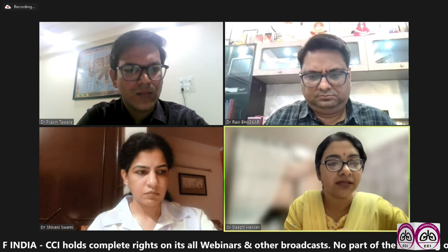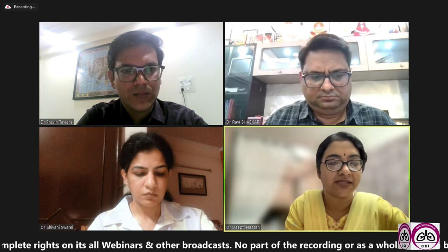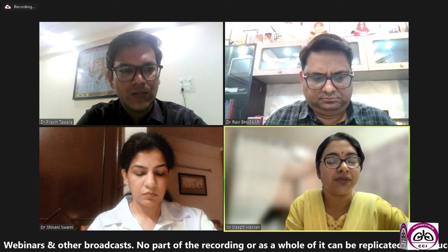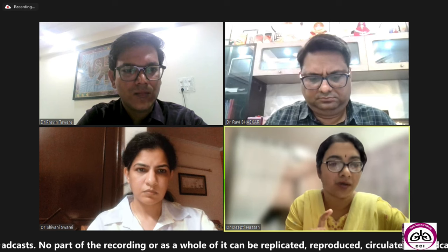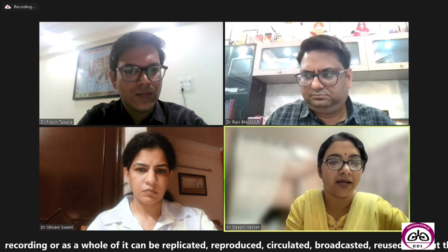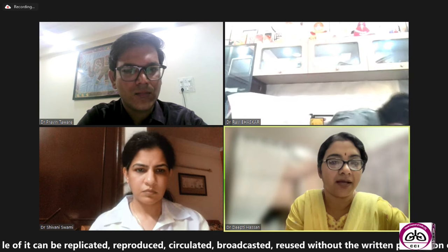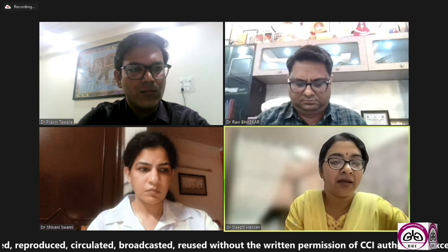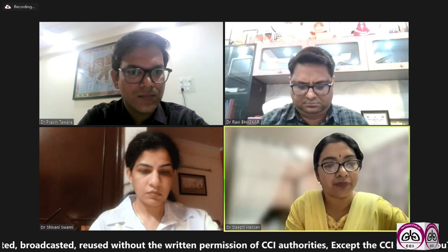So this issue comes up when they need it in an emergency, and they come and say, no, ma'am, the capsule is not working. There is no powder coming out. So it is so important for us to teach them that the capsule should not leave the box which has been provided, and how to keep it in the cover so that the moisture content is at a minimum. This is the major issue I have faced when patients have come back with their DPI inhalers.